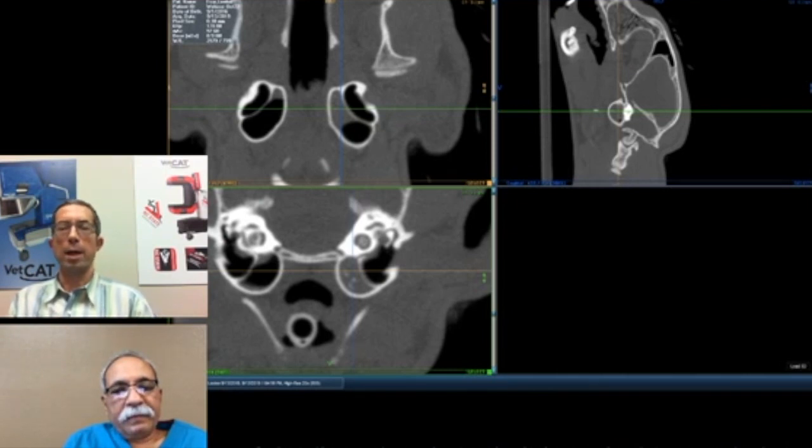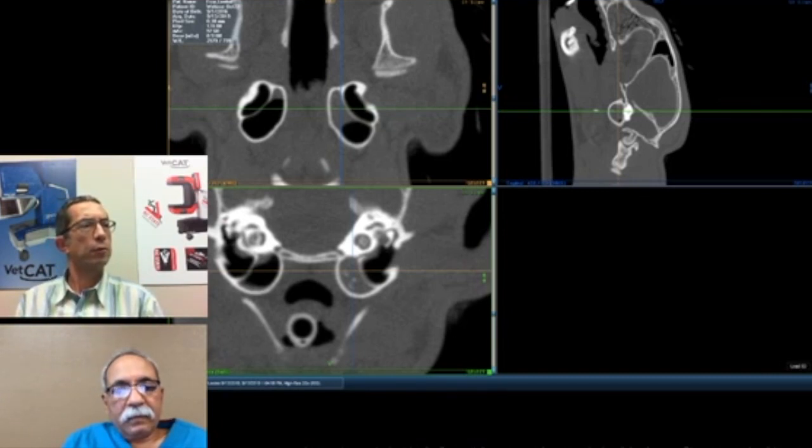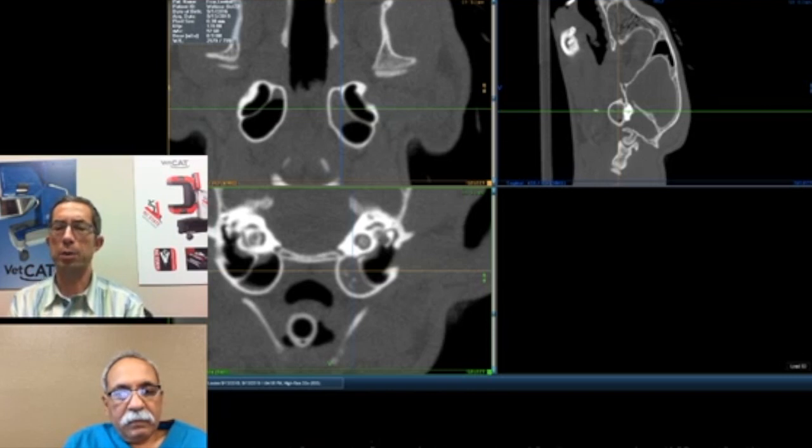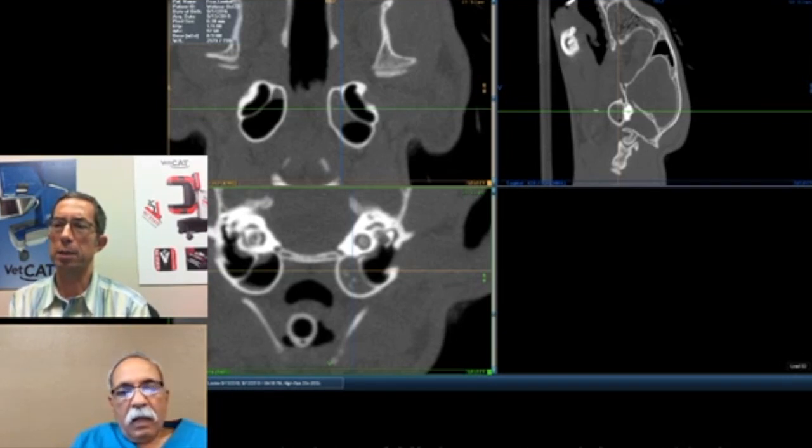Thank you, thank you. Another question here from one of our viewers. Are you able to use imaging differently than you used to in terms of following up on non-surgical cases, or how is your approach now in terms of procedures? You watch those pathologies and treat them maybe with medication first, or how do you go about this particular approach? So again, the ear is very complex.